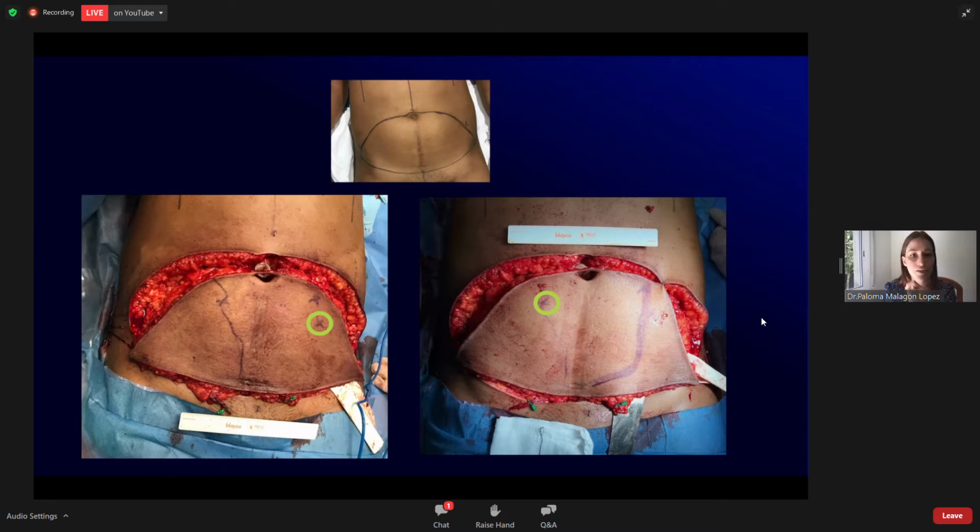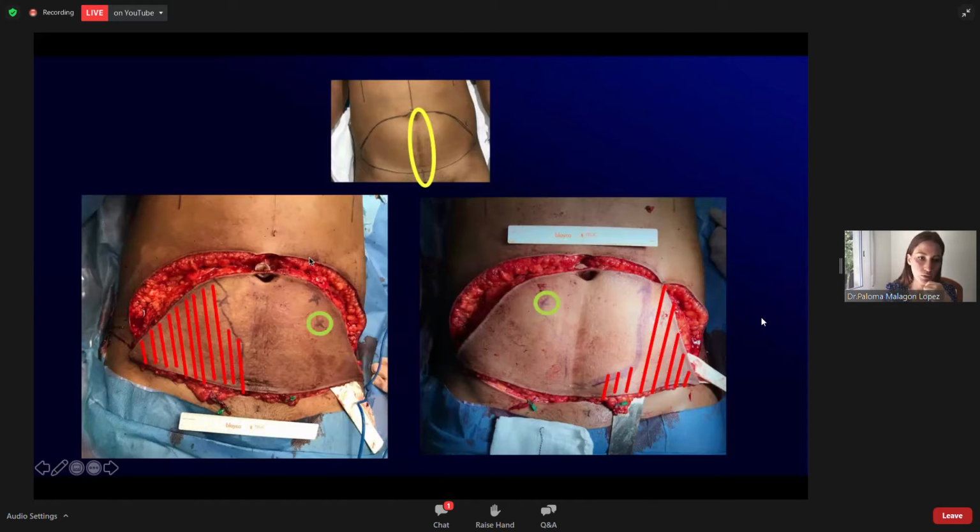During the surgery, we found 2 good perforators, one on each side of the DIEP flap, and we performed an ICG imaging to confirm the perfusion area of both of them. And here are the results. As you can see, the well perfused area of the left side perforator was much smaller than the right perforator. So we can choose this perforator easily.